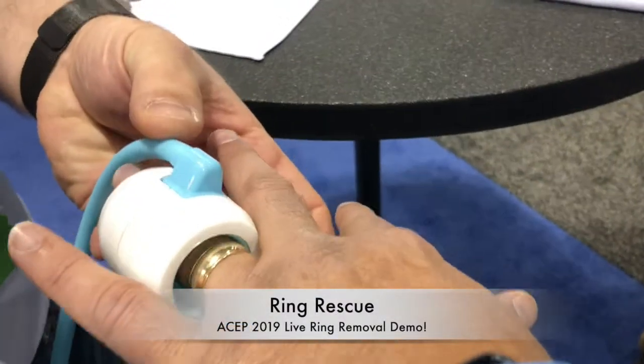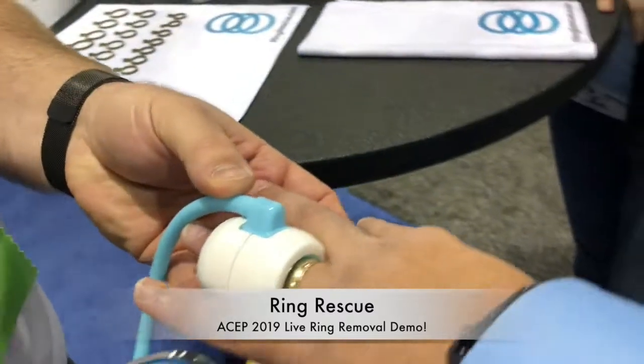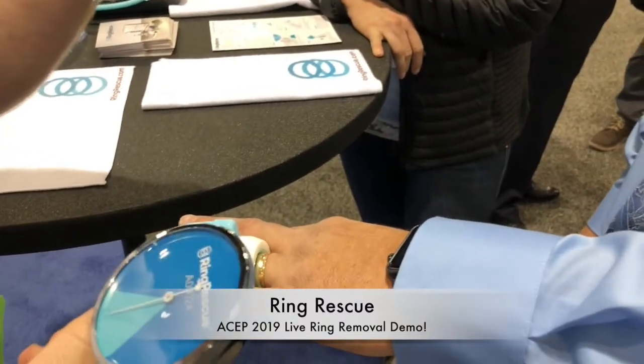Put it over your finger, directly over the knuckle so that we're not over the ring. If we're over the ring, we'll actually affect the compression because the ring will prevent the cuff from actually compressing the finger.